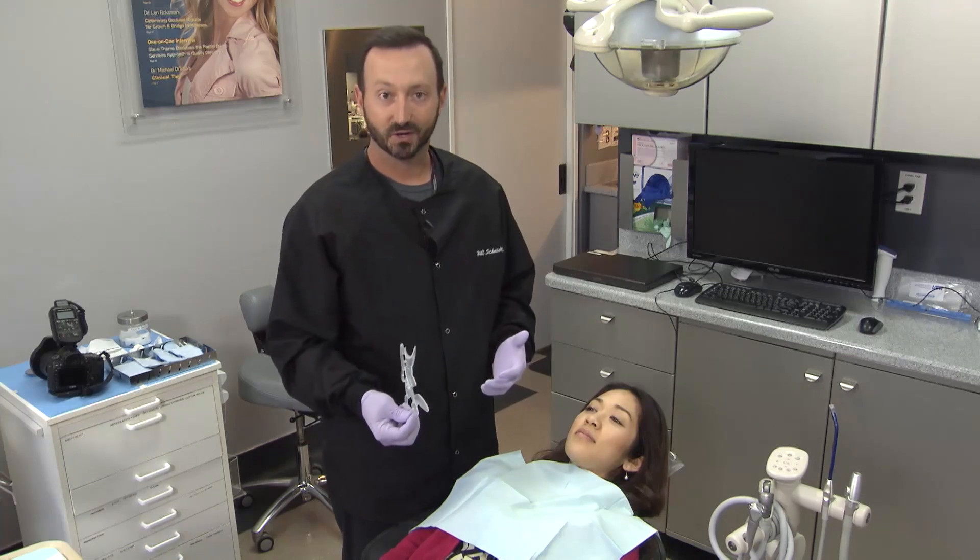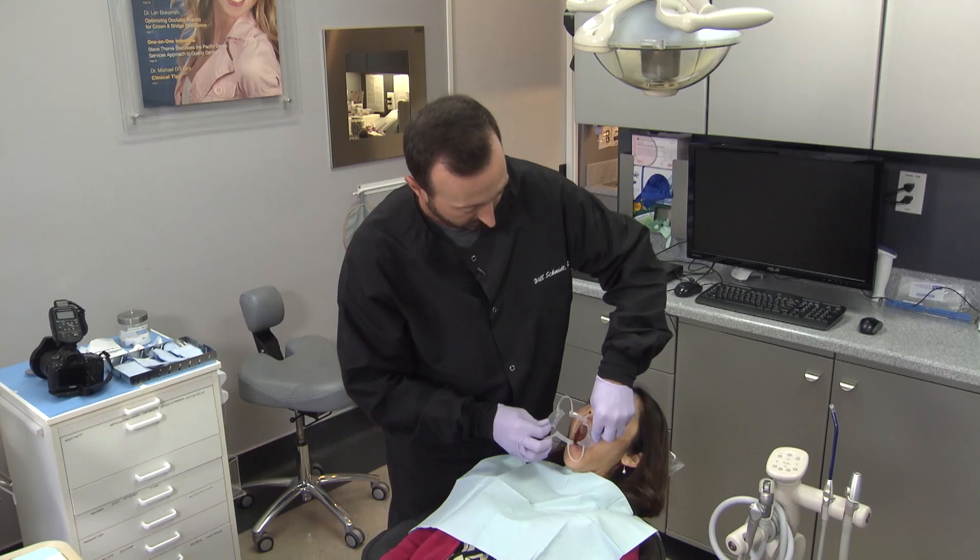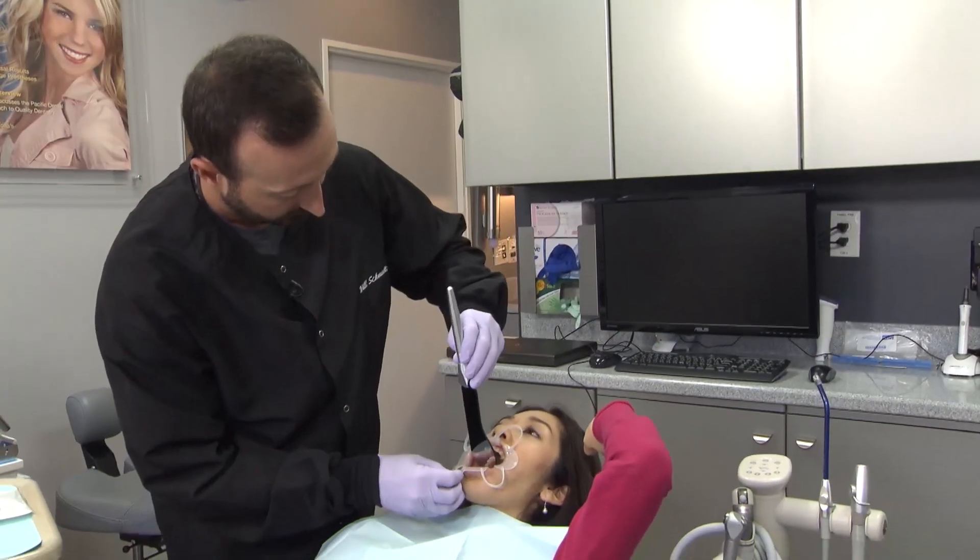I'll go ahead and start off with a plastic retractor just to get the lips out of the way. I'll take this first series of photos with this plastic retractor in place and show some examples of the OptraGate device afterwards.